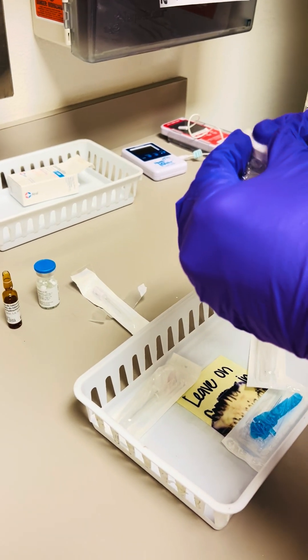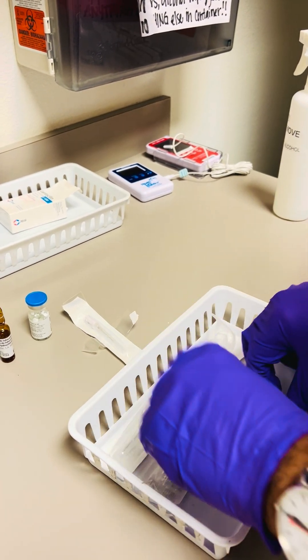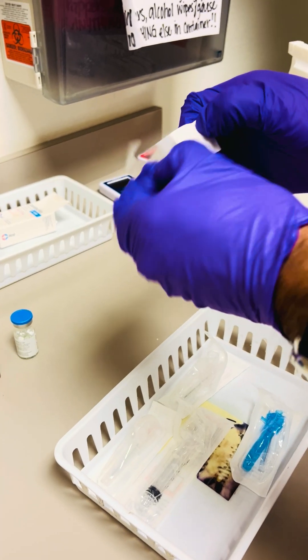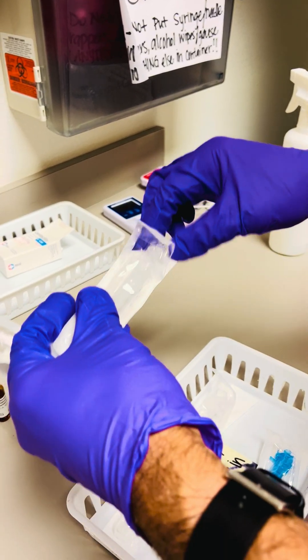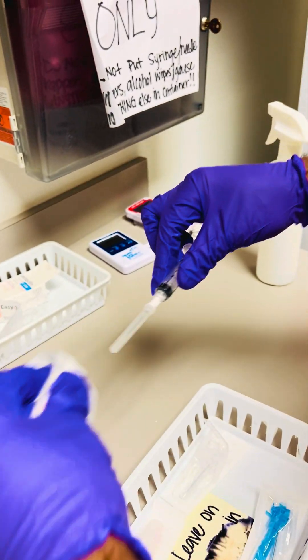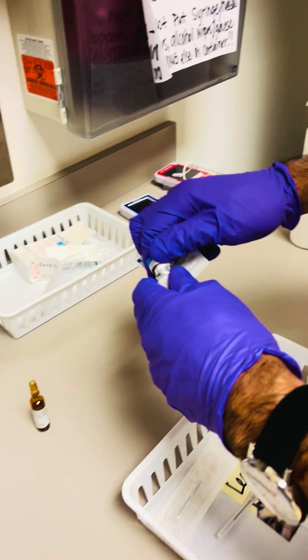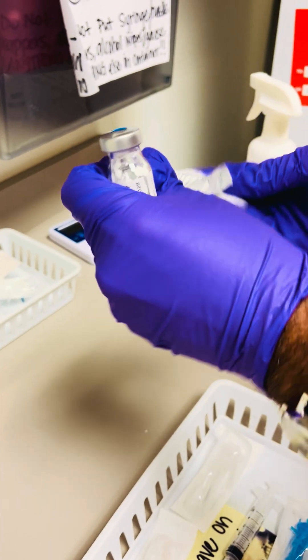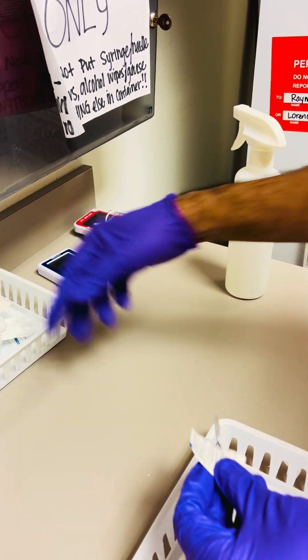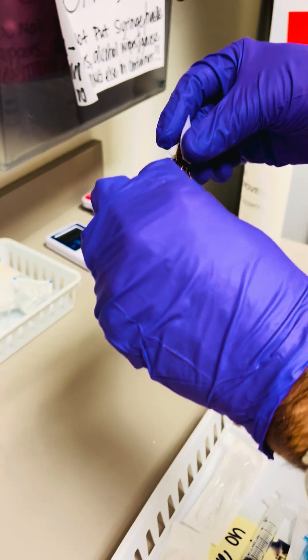Get everything ready. First, you'll assemble the 5 ml syringe with the filtered needle. Put that aside and then go ahead and sterilize the lyophilized powder vial and then the ampoule of lidocaine.